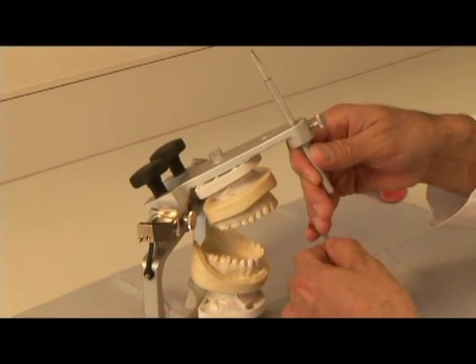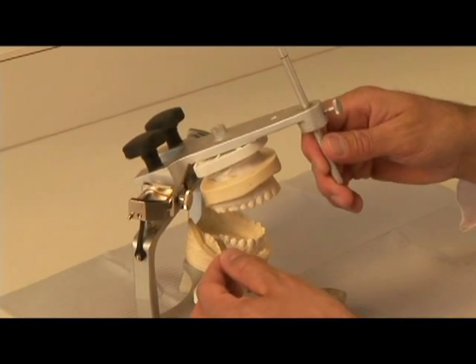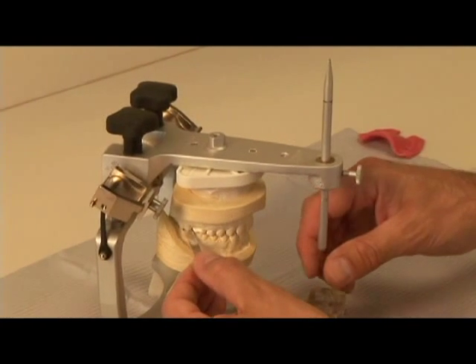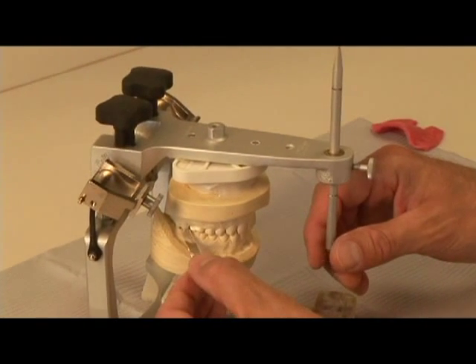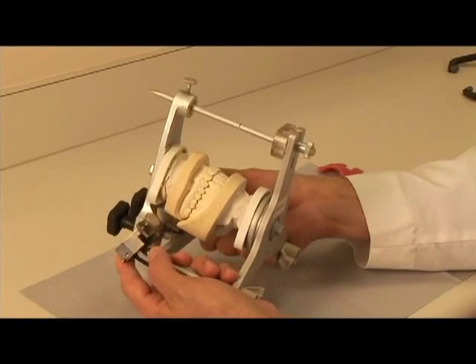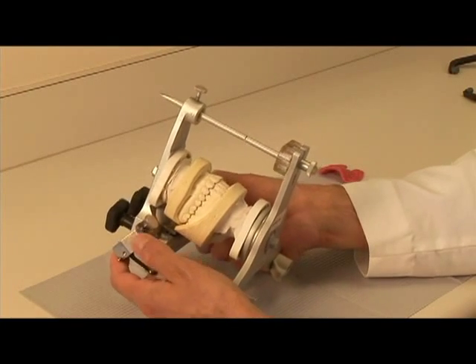Once the mounting stone has set, you can verify the accuracy of the mounting by using articulating paper and locating the same first contact on the cast as was identified by the patient. At this point, we need to evaluate for any slides or occlusal discrepancies.